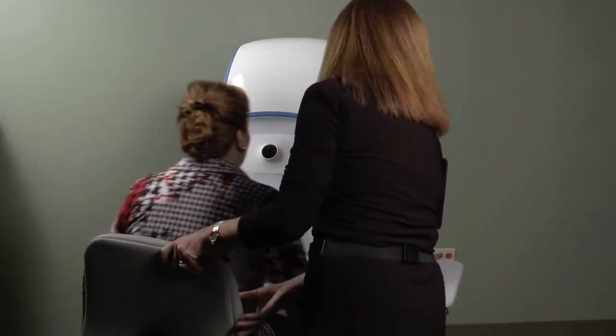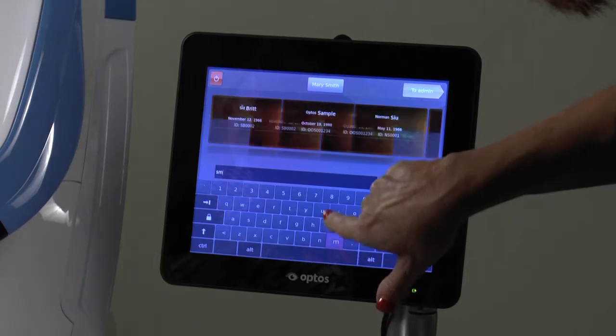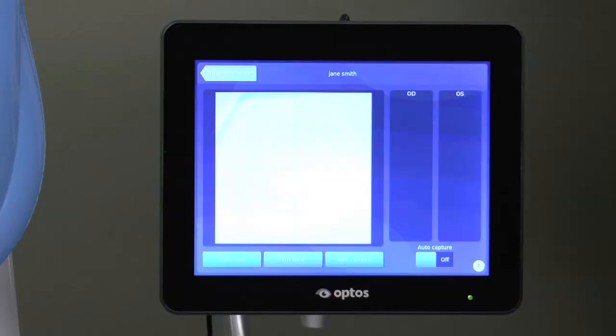Have the patient sit in the chair and move in close to the device. Pull up the existing patient record by typing in the first few letters of their last name, then select the appropriate patient and press the capture button at top right.